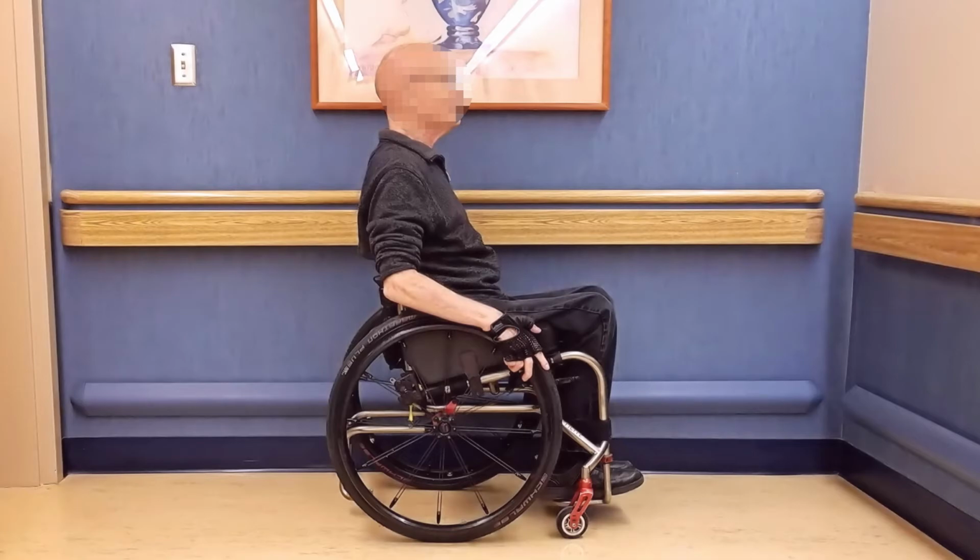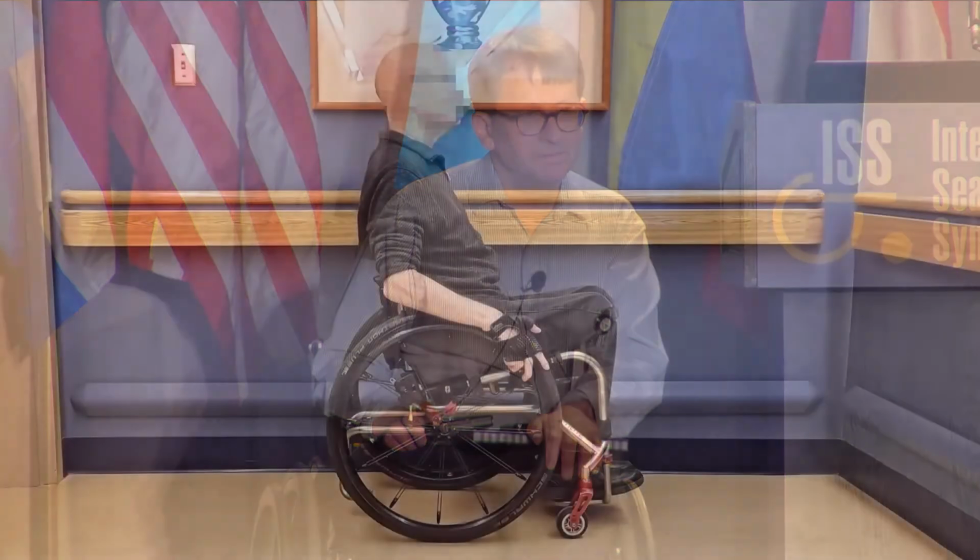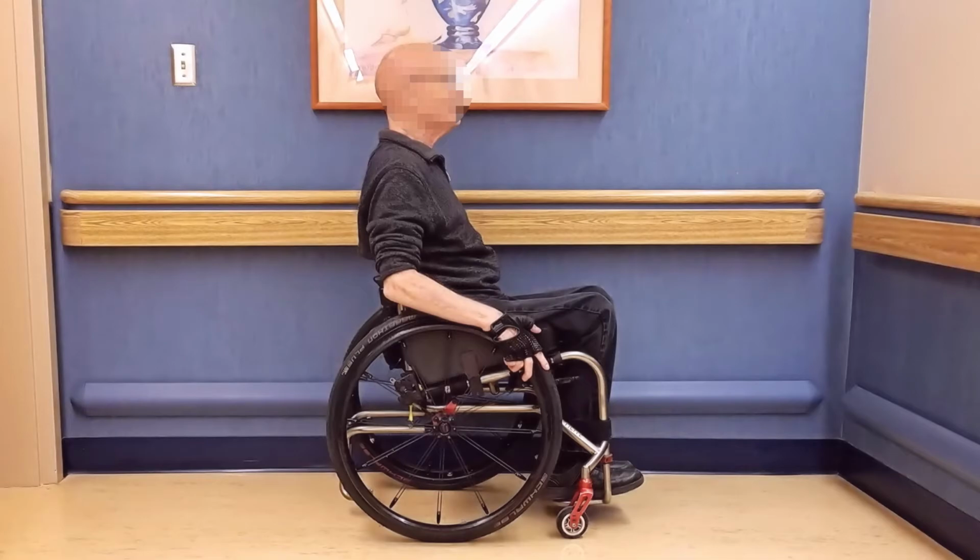If he doesn't have trunk control, which he does not, then what happens when he hits that little threshold in the bathroom? Or what happens when he is trying to navigate something because he really just doesn't have the force to navigate it. So this is where he's using the backrest to do skills. And he's really good. Another factor we need to consider is the mass of the user. He's a very light, small guy, so that allows him to move against gravity much more easily.